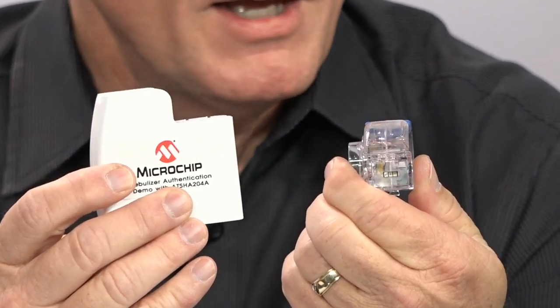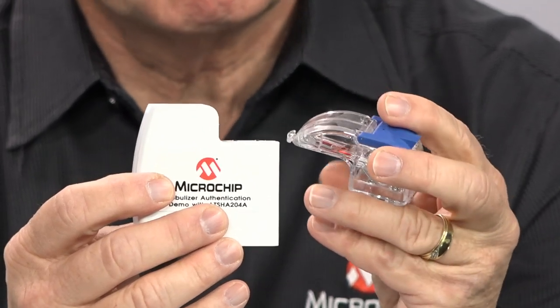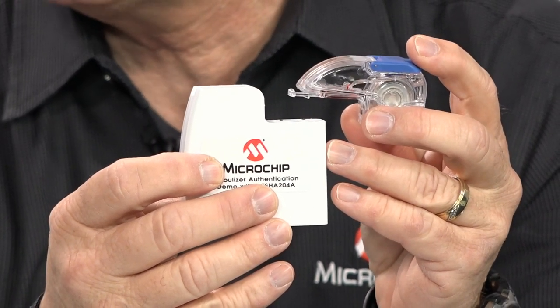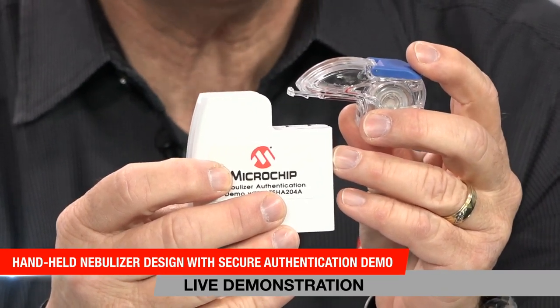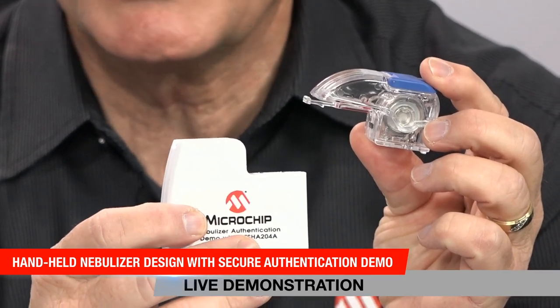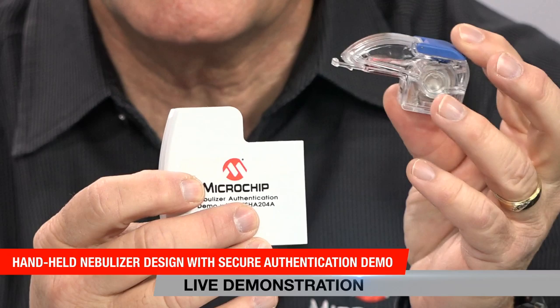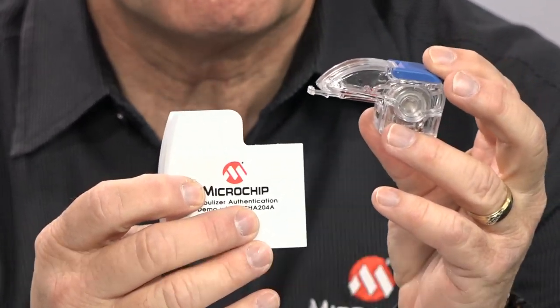Authentication, huh? Yeah, this is basically used to authenticate, because there are two different areas of security. We have security like encryption, and then we have authentication. Sometimes you authenticate a device to the web, like Google or AWS or whatever. Or you also want to authenticate because you want to protect a peripheral, something that's disposable, so it doesn't get counterfeited and people don't end up buying a counterfeit version of your medicine cup, in this case. Important, yeah. Probes, sensors that are disposable, or you don't want people buying something that's detachable from your medical device.